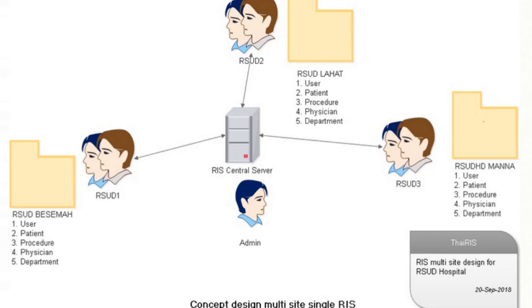And that becomes super important when a healthcare provider has multiple locations. Imagine trying to coordinate patient info across several clinics without a central system. Yeah, that's where RIS is crucial. That makes perfect sense. If a hospital network has different outpatient centers or imaging clinics, the RIS is kind of the glue holding it all together, making information accessible.